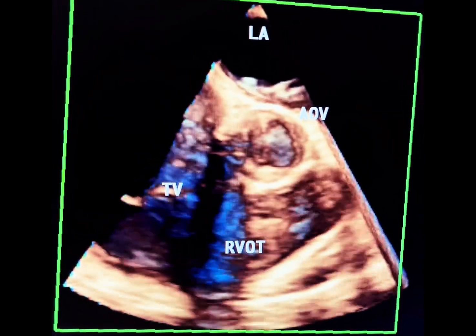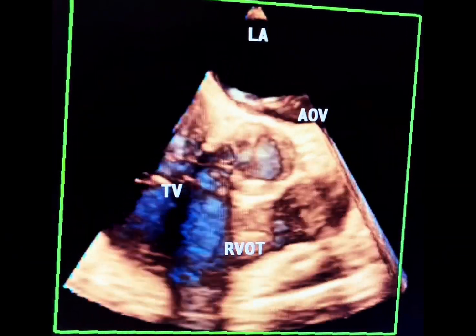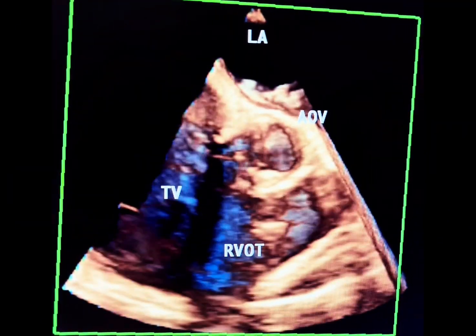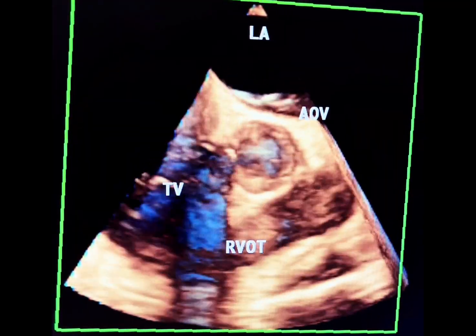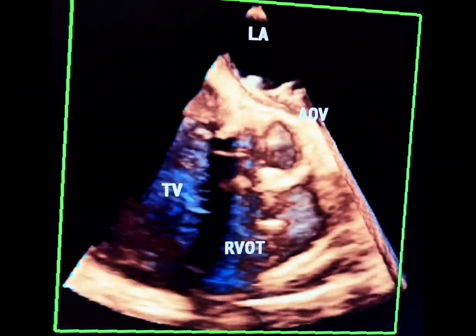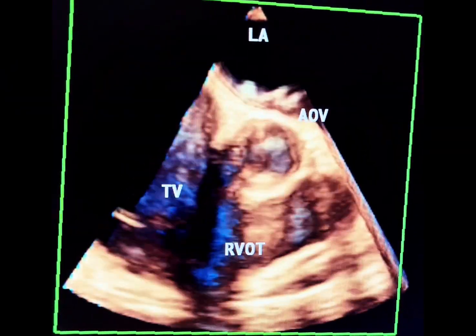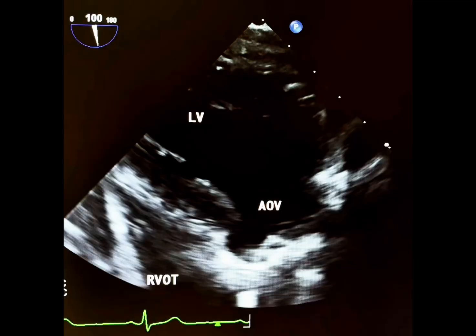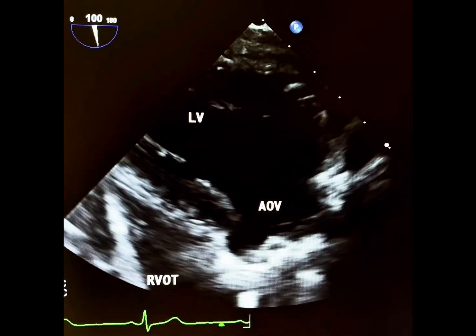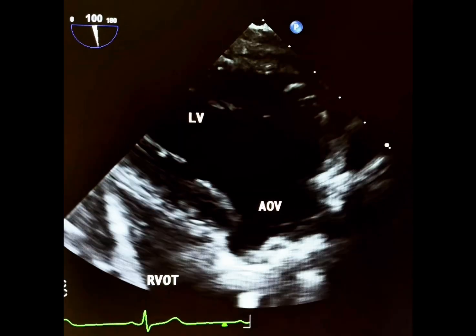Following successful AVR and relief of severe aortic stenosis, LV hypertrophy should regress. Severe PPM may blunt LV reverse remodeling. Therefore, persistent LV hypertrophy months after AVR should raise suspicion for clinically significant PPM. In this deep gastric TE view, aortic mechanical valve motion appears normal, indicative of a PPM.